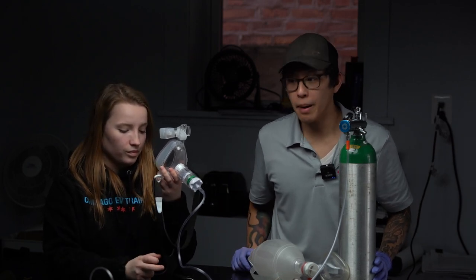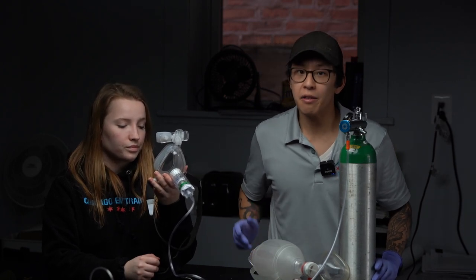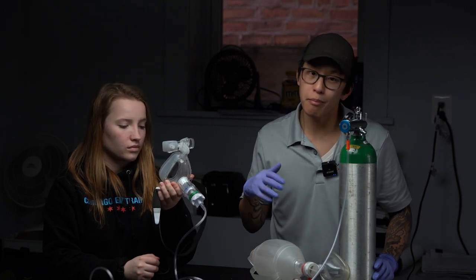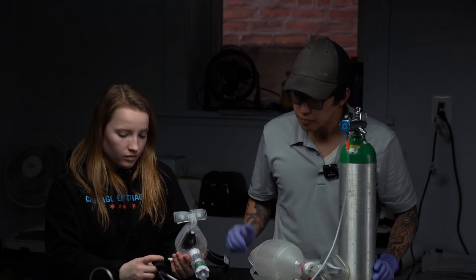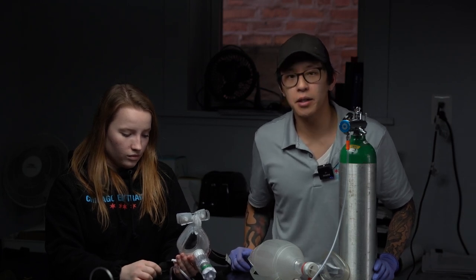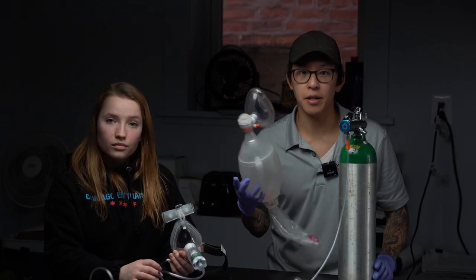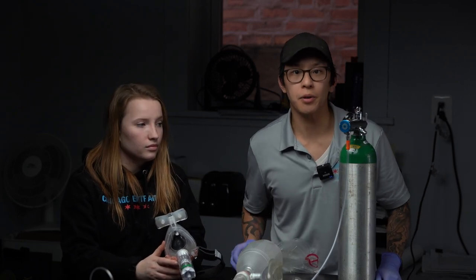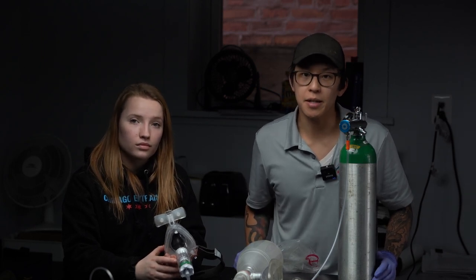Some things to remember when utilizing CPAP: our patient needs to be alert and oriented times 4. If they're anything less than that, their tongue might be compromised and there may be a risk of their tongue falling back and partially occluding their airway. CPAP is very useful — if someone is on the tail end of respiratory distress, we should aggressively manage that. It can prevent us from needing to utilize positive airway pressure ventilation with a BVM and escalating to an i-gel. We always opt for the least invasive option, which in this case would be CPAP.